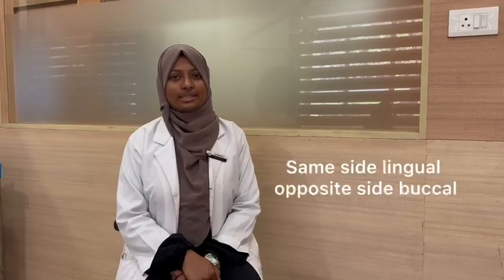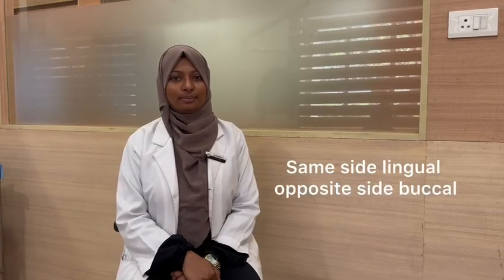Today we are going to learn about a dental radiographic technique SLOB, also known as same side lingual and opposite side buccal. Often objects such as root, implanted teeth or any foreign bodies may overlap on the same radiograph. SLOB helps us to identify whether it is on the lingual side or buccal side by taking a second radiograph.